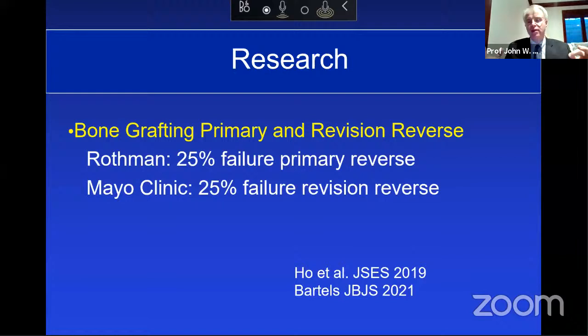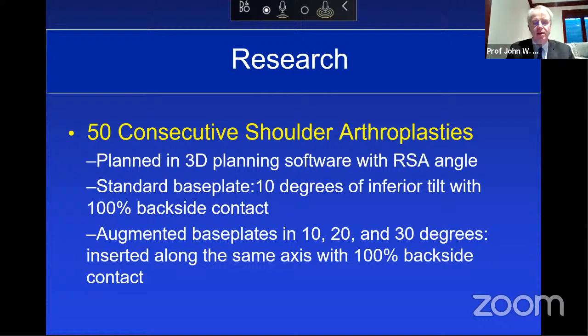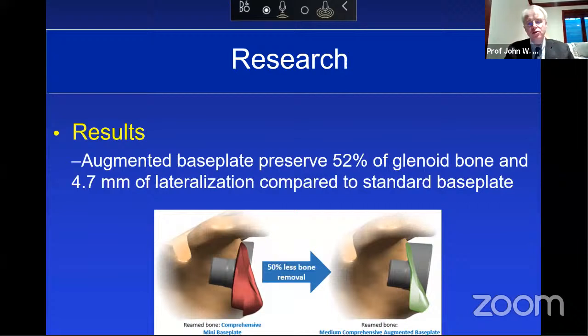So I think our hip and knee colleagues would say, "We figured this out years ago. Bone graft is not a great idea. You should think about metal." So how much bone can you preserve with metal compared to eccentric reaming? And this was a study done by Tom DeQuinn, one of my former fellows. And the bottom line is you can save over 50% glenoid bone.